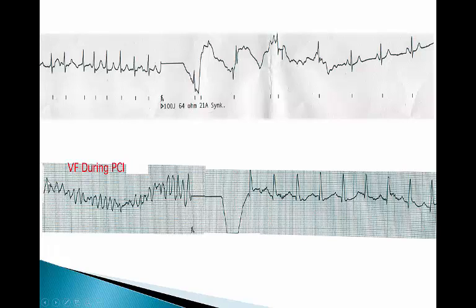Okay, this patient was in VFib. Even worse. Shocked them. All right. Defibrillated them, if you will, and now they're back into, well, some kind of organized rhythm. It's hard to tell what that is. It could be coming back into sinus. See how you've got a P wave starting here, P wave, P wave, P wave. So it's probably back into sinus. So that's good. But then the trick is, do they have a pulse?